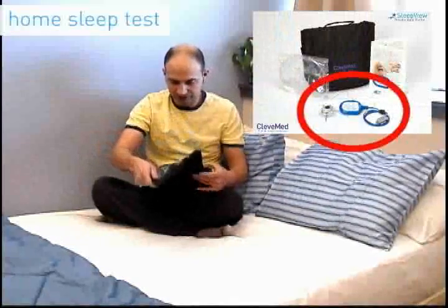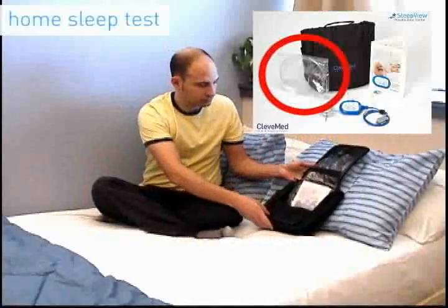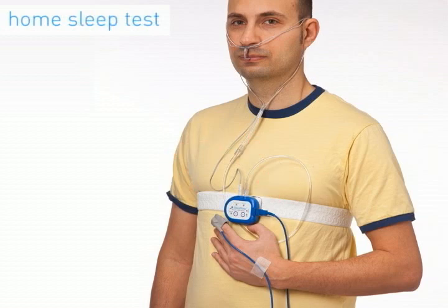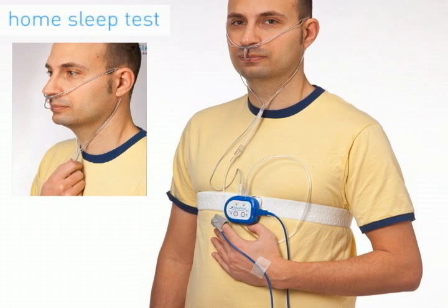The patient brings the SleepView kit home with the SleepView device already attached to all the required sensors, except the nasal cannula, which is in a sealed bag. The respiratory effort belt wraps around the patient's chest so that the attached SleepView is positioned in the center of the chest. If a thermistor is provided, the free end of the thermistor is first inserted into the nasal cannula. The prongs of the nasal cannula are inserted into the patient's nostrils, with the oral tube bending down towards the patient's mouth.